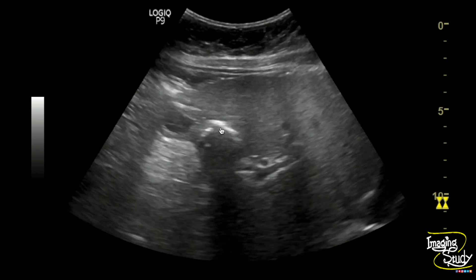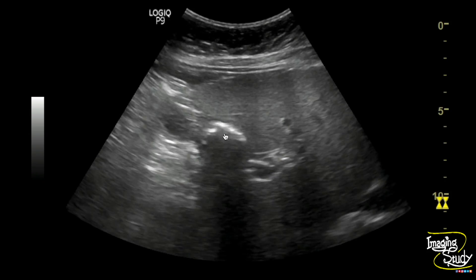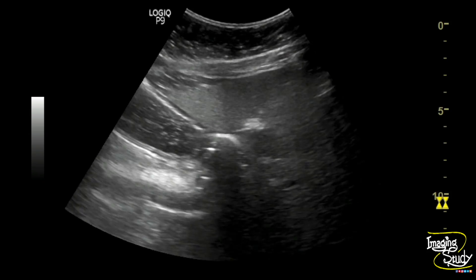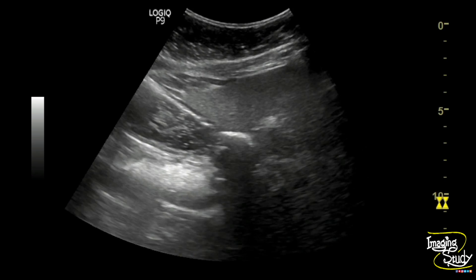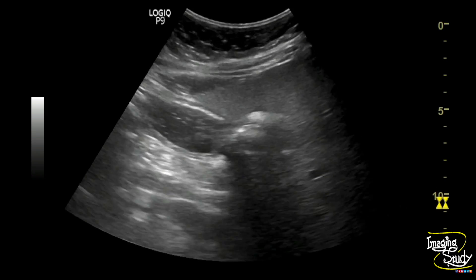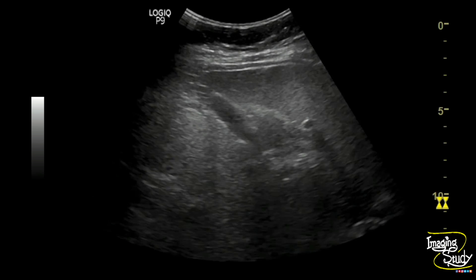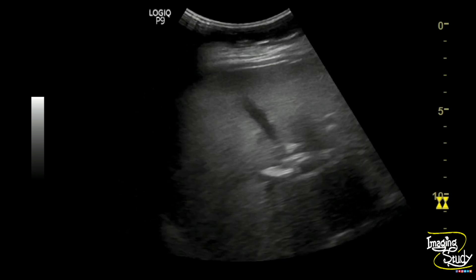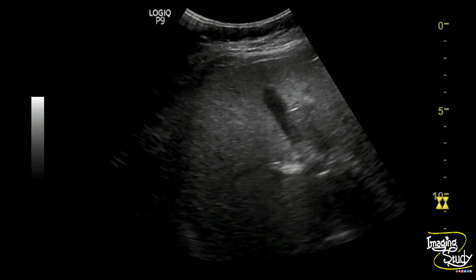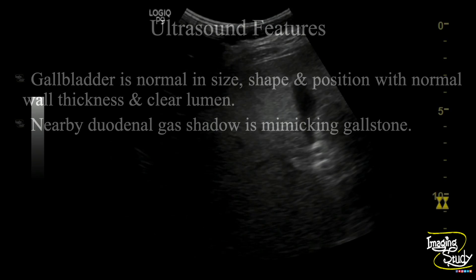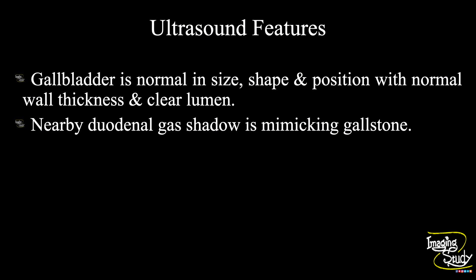As confirmation, you can see the hyperechoic area is quite fragmented when scanning now, and when you scan from a different angle, a stone should maintain its shape whereas air will change. So this is nothing but a normal study. In summary, the gallbladder is normal in size, shape, and position with normal wall thickness and a clear lumen. The nearby duodenal gas shadow is mimicking a gallstone.